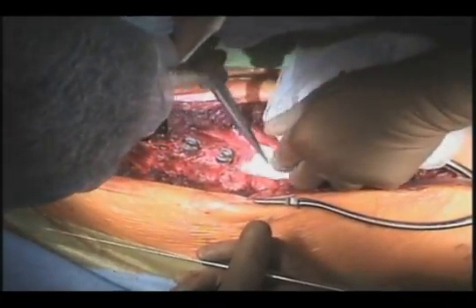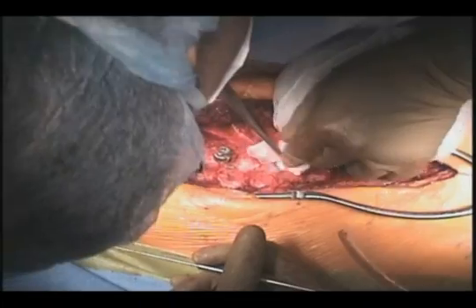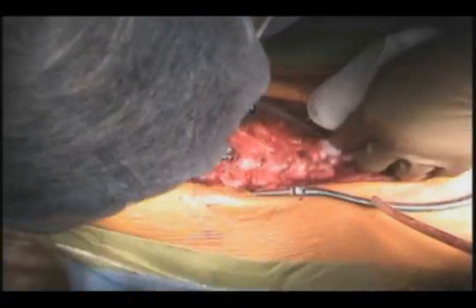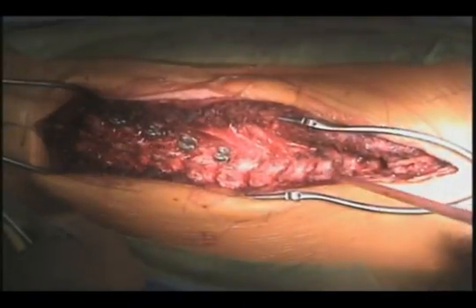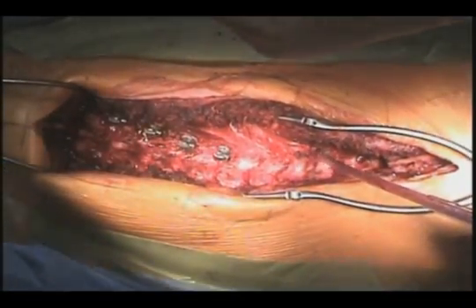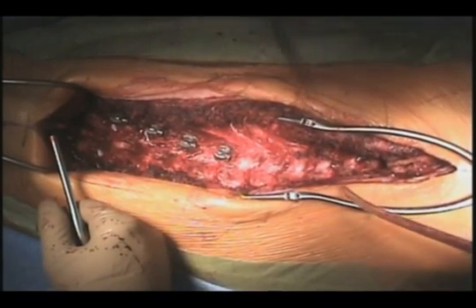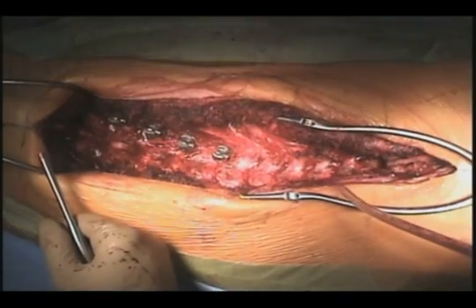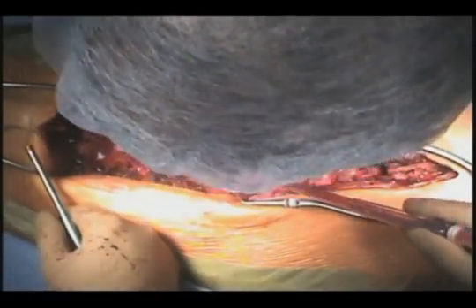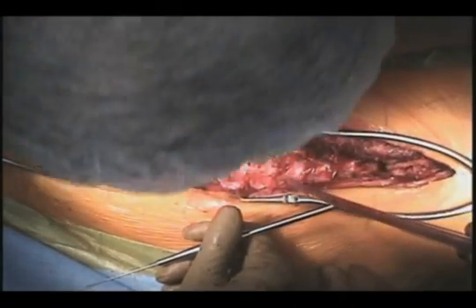Due to difficulty with anatomy. And you can see this is a fairly dry field, and the reason for that is we have controlled blood pressure. On exposure, we use a mean arterial pressure of below 75 millimeters of mercury, and this results in less blood loss on exposure. That and meticulous dissection, of course, is important. As we do the correction of the spine, we allow the mean arterial pressure to drift upwards towards 80 or 90 millimeters of mercury. This is in order to be protective to the spinal cord during correction.